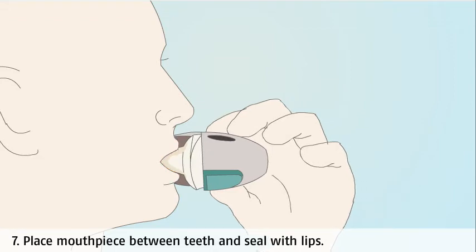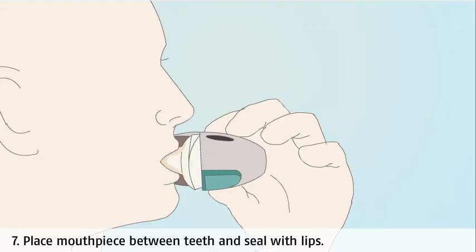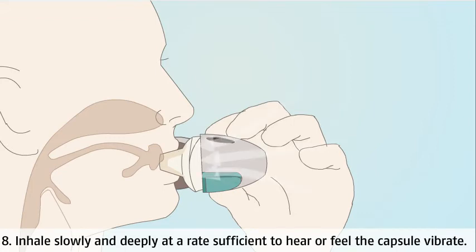Place the mouthpiece between your teeth and close your lips around it. This prevents your teeth being sprayed and creates a good seal with the lips so that the medicine doesn't escape. Breathe in slowly and deeply at a rate that allows you to hear or feel the capsule vibrate. This ensures that the powder moves from the capsule through the device and into the lungs.